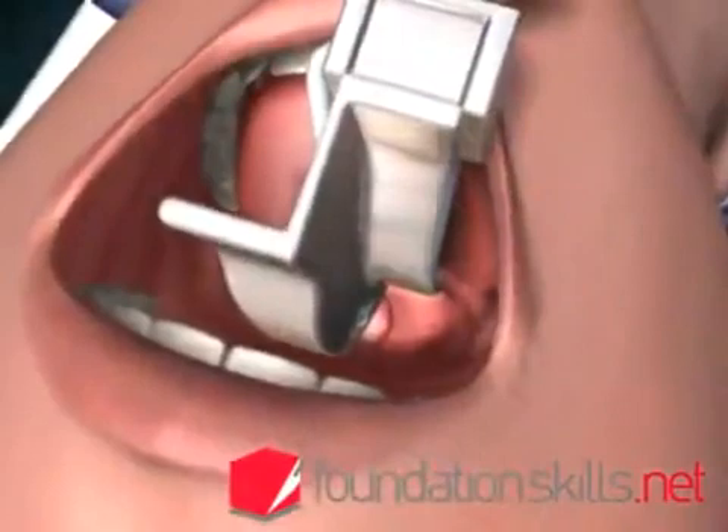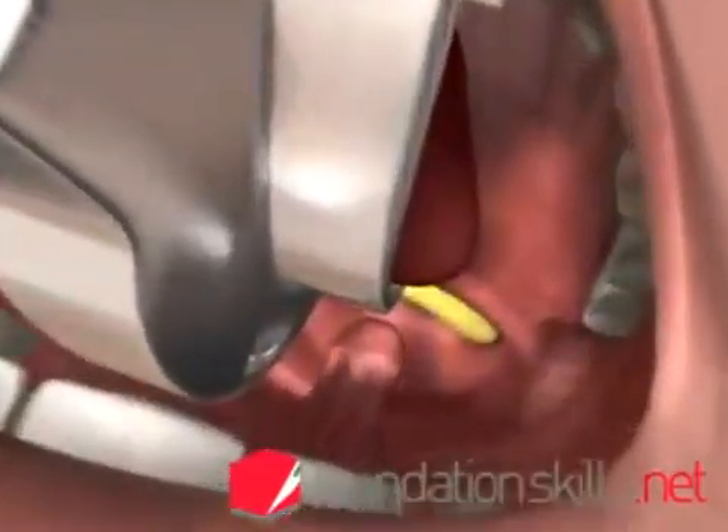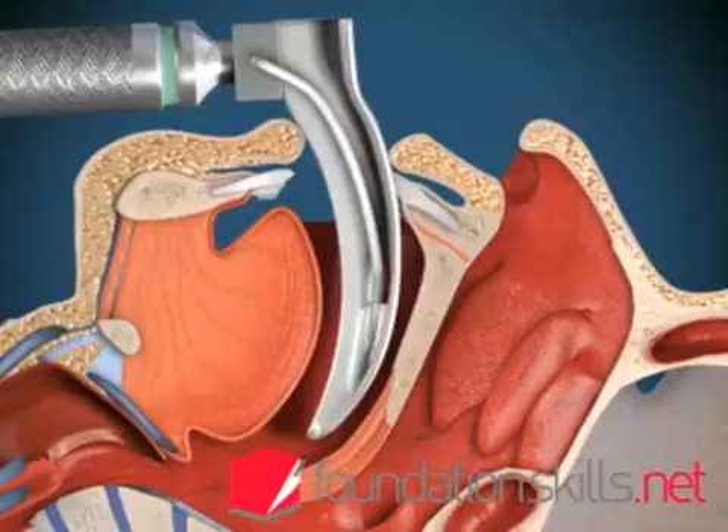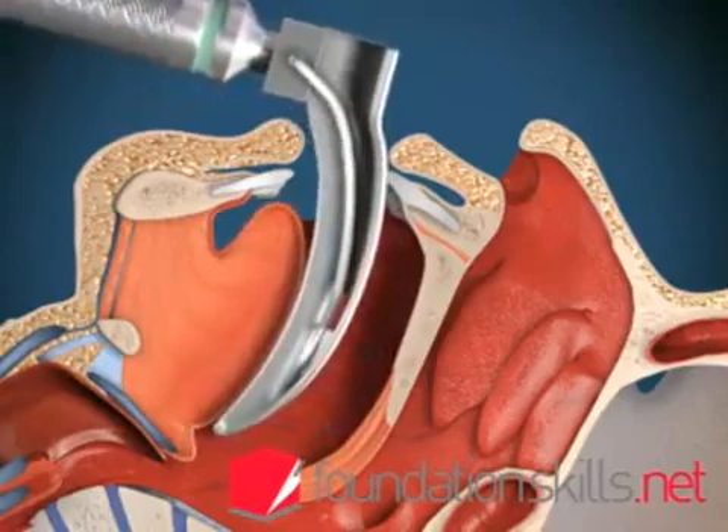Advance the laryngoscope slightly until the tip of the epiglottis can be seen posterior to the back of the tongue. Advance the tip of the laryngoscope blade into the vallecula between the epiglottis and the tongue.